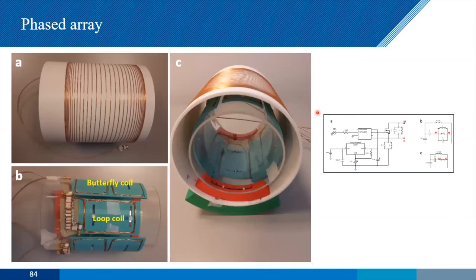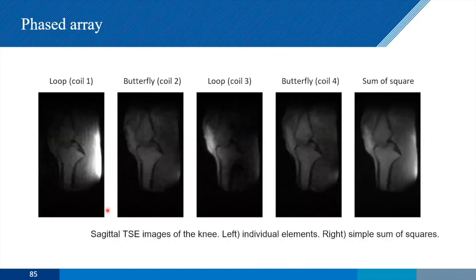And so Javed Paraza in our lab has started to work on these. You can see the coils over here, with an impressive half of our supply of non-magnetic capacitors. And again, you can't just use surface coils all the way around. You have to use butterflies and loop coils, etc. In initial results, he's been using a 4 coil array with a fairly simple sum of squares reconstruction, and we can get a reasonably good image here of the knee and all of the individual components over here.